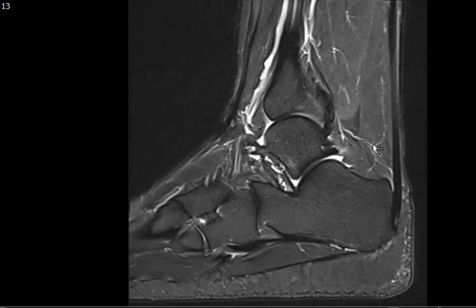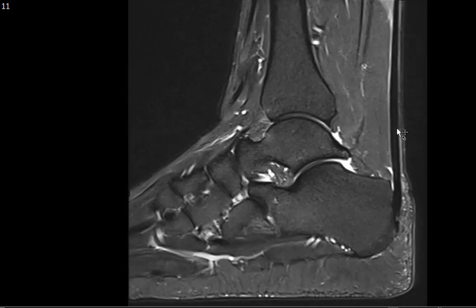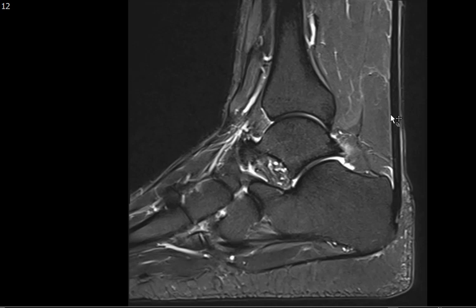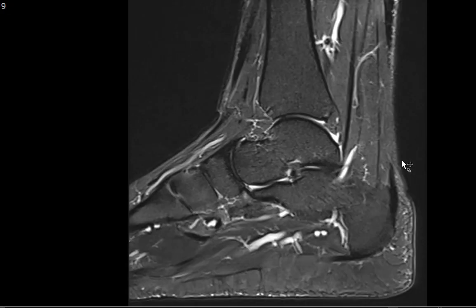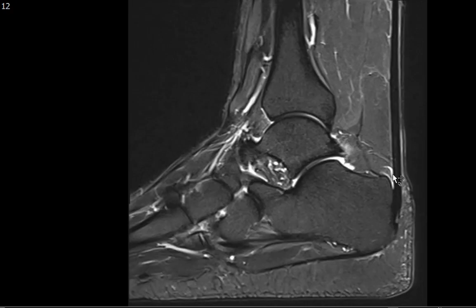Another important structure on the sagittal image is the Achilles tendon — this hypointense band inserting onto the calcaneal tuberosity. Most tears occur two to six centimeters from the insertion. Notice there's no tear here and no tendinosis. If the AP diameter is more than eight millimeters or there's a convex anterior border with intermediate signal, you'd suggest Achilles tendinosis. This is a normal appearing Achilles tendon. There is some trace fluid here — this is called the retrocalcaneal bursa. This is Kager's fat pad, with no infiltration.